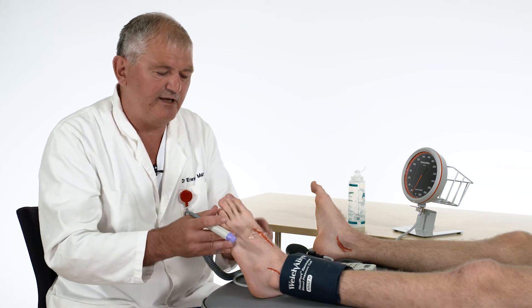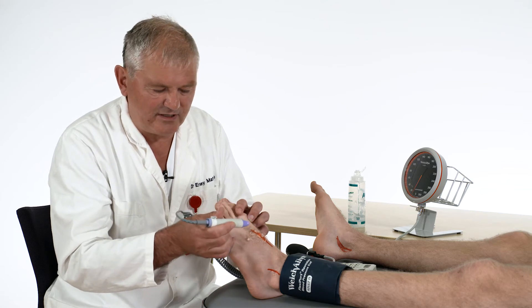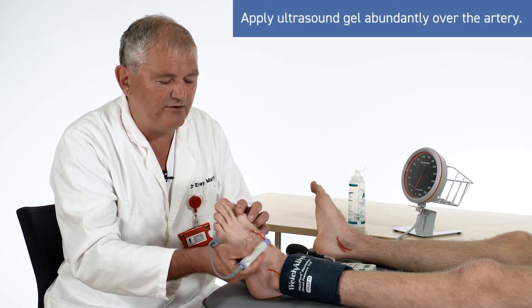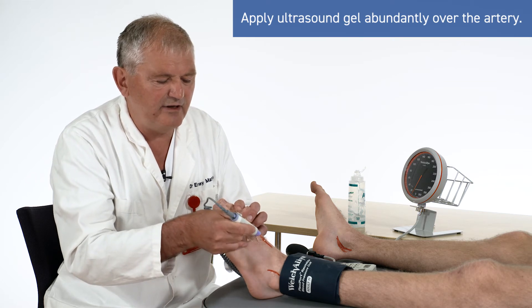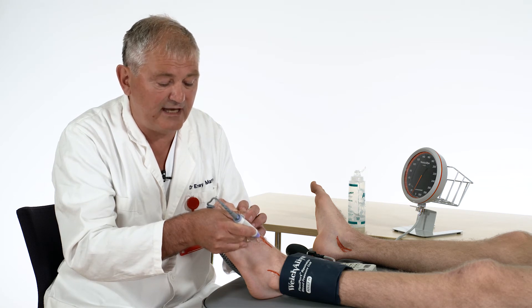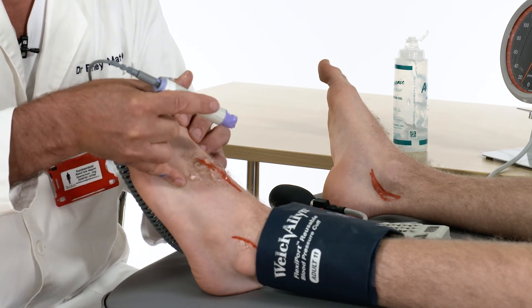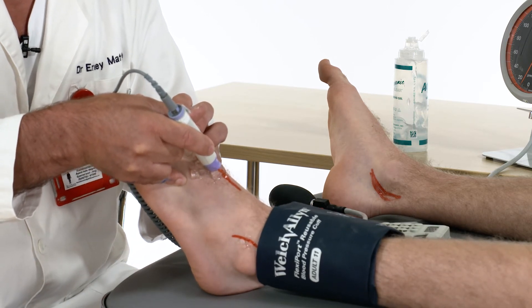We can start with the dorsalis pedis artery. This is a very superficial artery, and it is therefore very easy to compress the artery with the probe. To avoid this, have a lot of gel placed above the artery and let the probe bathe in that gel without any contact with the skin. Keep the probe like a pin and stabilize your hand with your little finger.